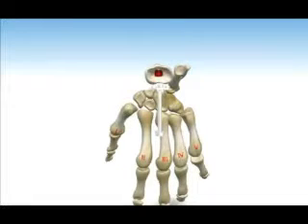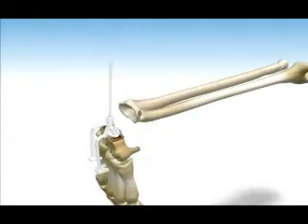Use the PGT metacarpal drill guide to assist in alignment over the second and fourth metacarpals. Use of radiography at this point is recommended to ensure proper positioning. Pre-drill with a 2 mm drill bit through the carpal template into the distal scaphoid in preparation of carpal screw placement. Crossing the second carpo-metacarpal joint is an option that many surgeons prefer to do. The second carpal screw is pre-drilled through the length of the hamate but not across the fourth carpo-metacarpal joint.